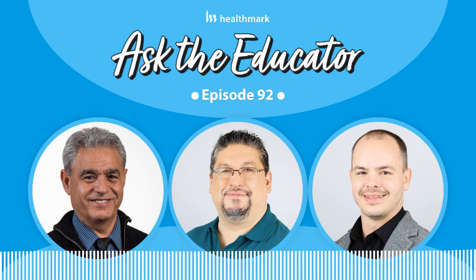So, Jahan, can you give us some examples of things that have happened from damaged cords? Sure. The best source is the FDA Manufacturer and User Facility Device Experience, or MAUDE, database. In that one, I usually see the tip of the iceberg. If you search for surgical fire or cord, you come up with, I just did one today, and at least five examples that I can bring up. For example, one of them said a monopolar cord that obviously had additional complaints in the past.